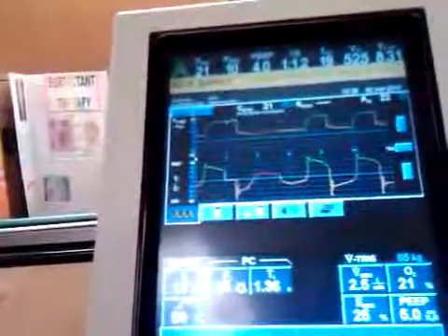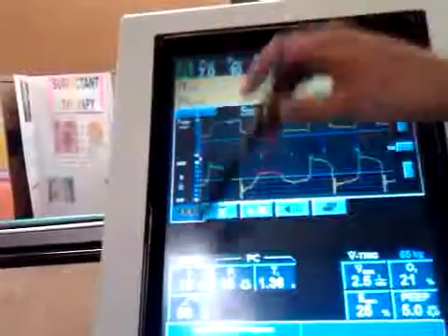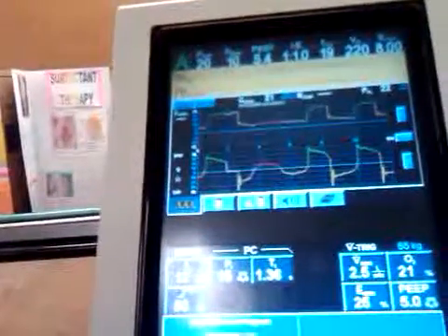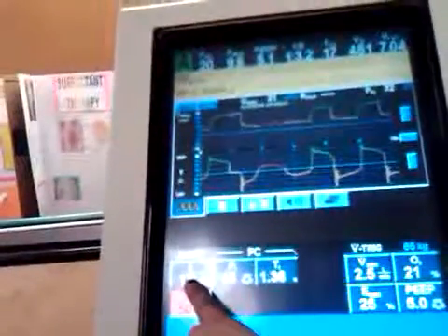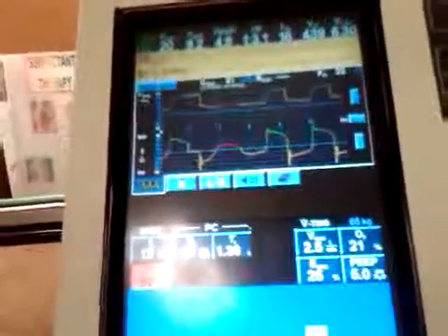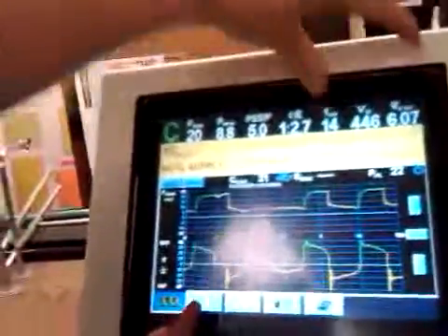Also need your set respiratory rate. Yes, your set respiratory rate, which is total 12 respiratory rate. And that's going to be, no, this is your mechanical. You just need that. That's your mechanical one. So once you have all those numbers, you need 4 numbers. You need the total, these 2, total respiratory rate.